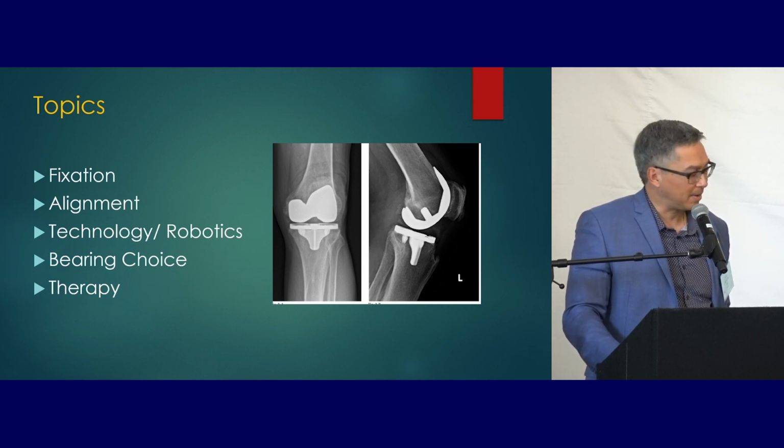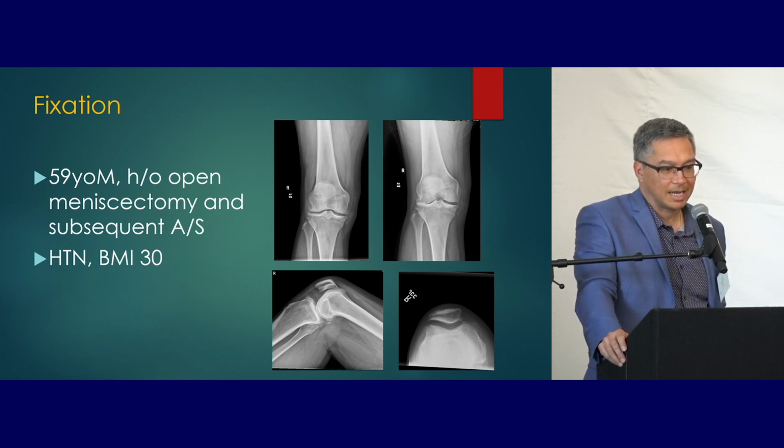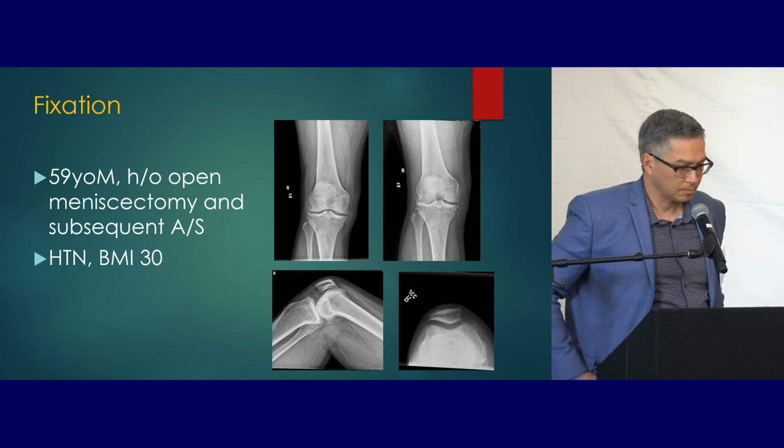And to my panelists, these are not trick cases or anything, very straightforward, but we're going to talk about some of the underlying ideas behind how we do total knees. So this is a 59-year-old man, had an open meniscectomy many years ago and a subsequent arthroscopy, hypertension and a BMI of 30. So just in terms of fixation alone, what would be your fixation choice for your primary total knee, Keith? So for primary total knee in a 59-year-old male, I'm going with the plan of cementless fixation.